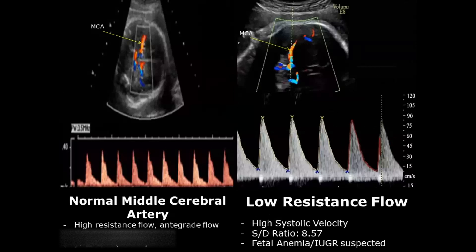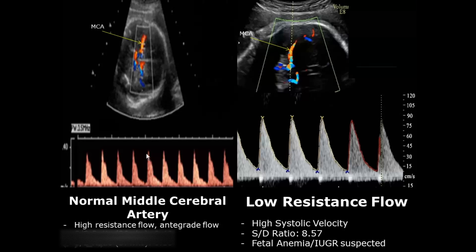A low-resistance flow is abnormal — we will see high velocities. Here you can see the PSV is almost 80 centimeters per second, whereas in the normal case it is below 40 centimeters per second. The SD ratio is very high at 8.57, which can be a sign of fetal growth restriction or anemia.